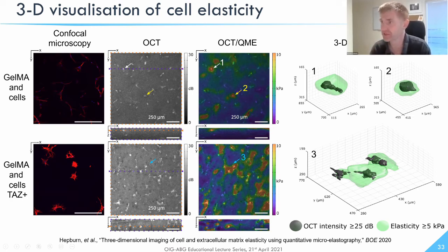But really, when we increase the resolution, and combine that with some of those computational approaches to be able to look at subcellular components, it could be quite a useful technique in some applications in mechanobiology. We feel the advantages are to be able to look in 3D. We can perform this imaging in a matter of 3-4 seconds. And we're also able to look at fairly large spatial fields of view.